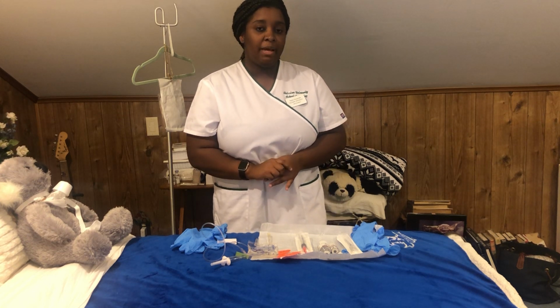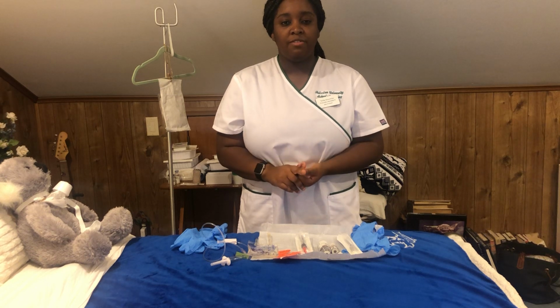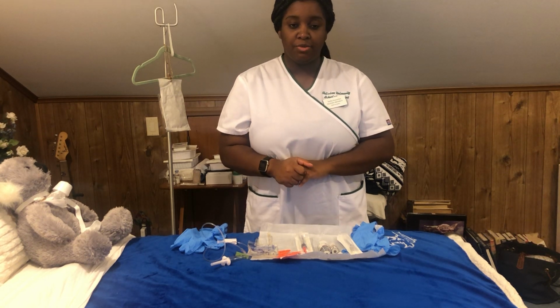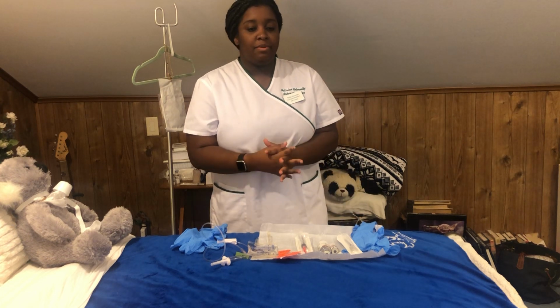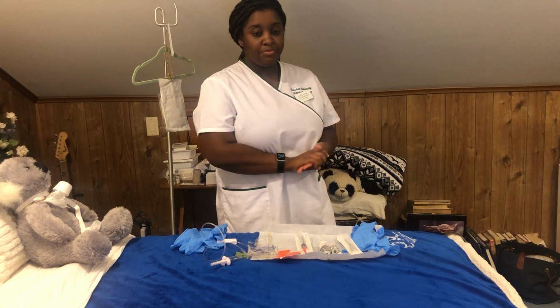For this video, I will be doing IV piggyback medication administration. This first part of the video will technically be done in the medication administration room. And so the first thing to do is to perform hand hygiene.